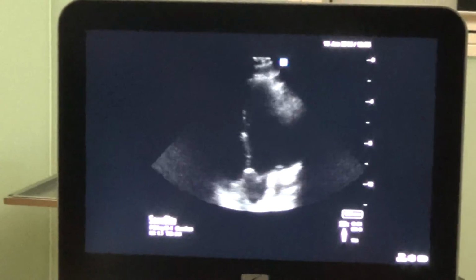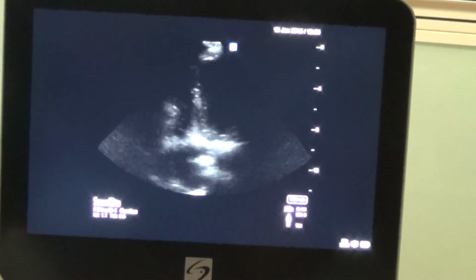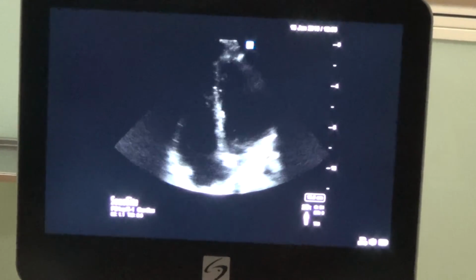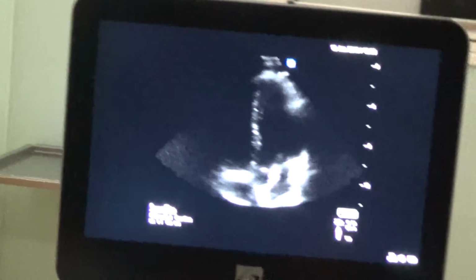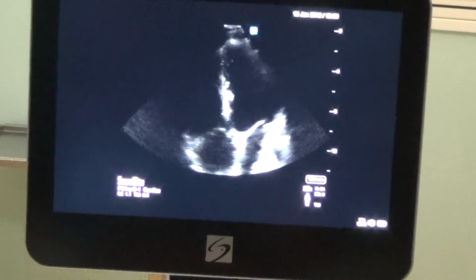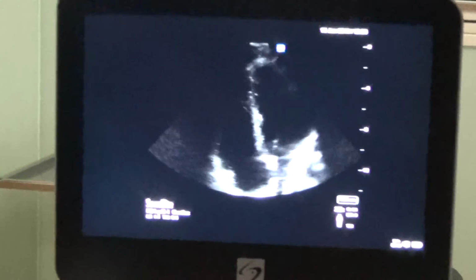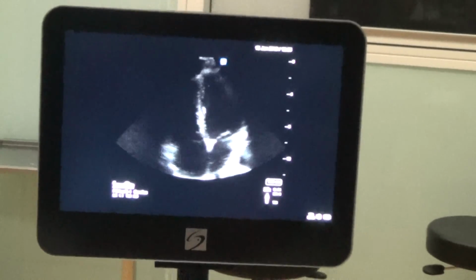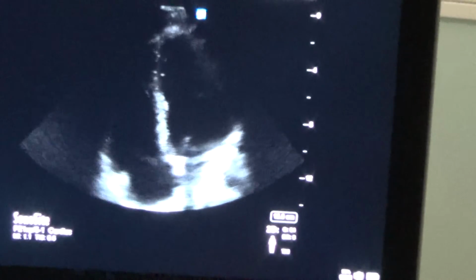Basically our aim is to get as much information as possible from echocardiography for the anesthesiologist, and gradually we'll go for liver, kidney, and all those things. What are the basic things we need to know? Now, in the next episode, we'll go for facet joints, cervical spine, thoracic paravertebral, intercostal, everything we'll cover one by one. Thank you very much.